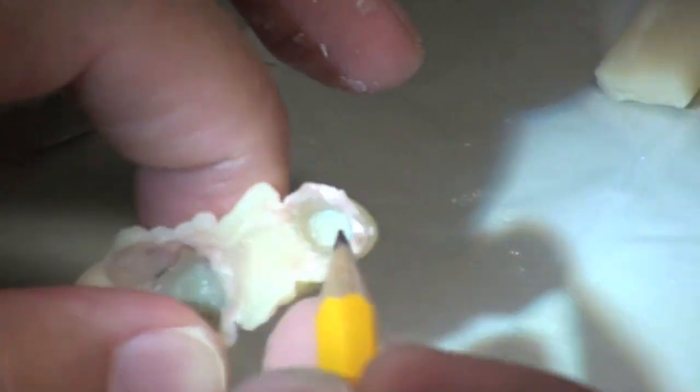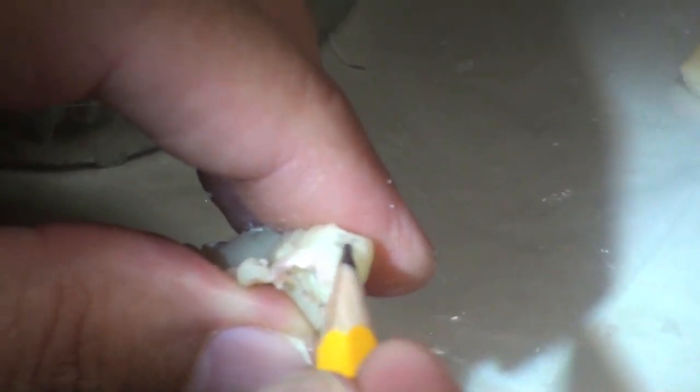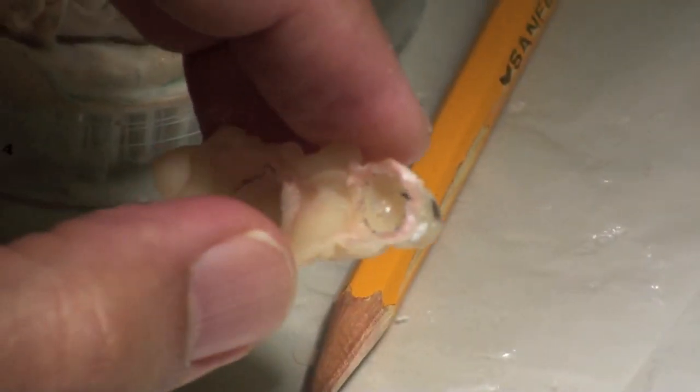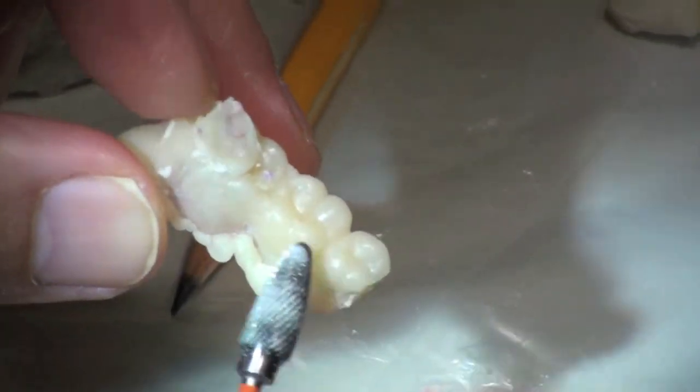Alright, so I can see those lines. I'd also highlight your contact area and you don't want to touch that. So now we've got the top more or less the way we want it. We can see where those bottom lines are.